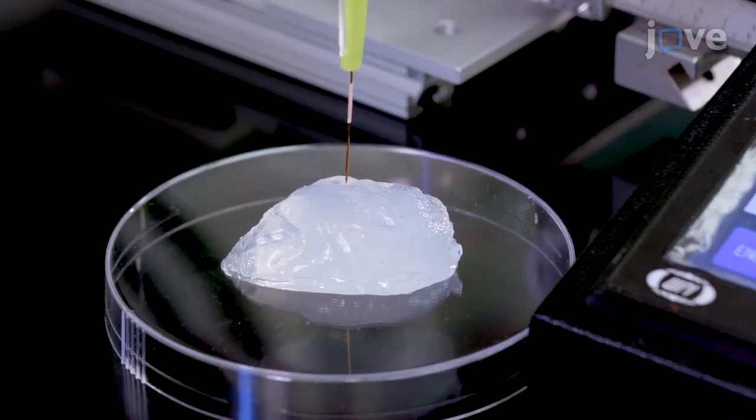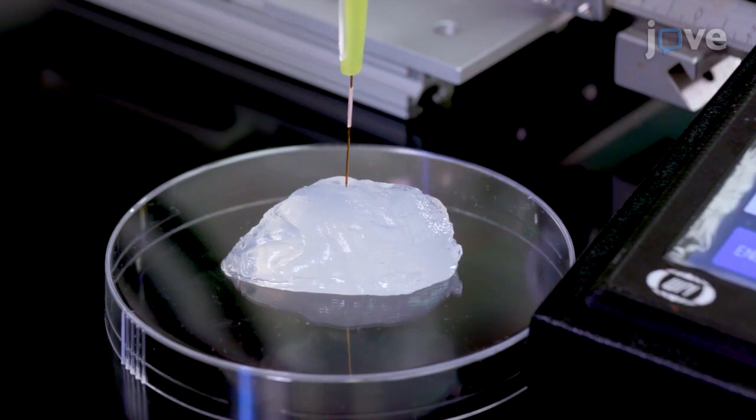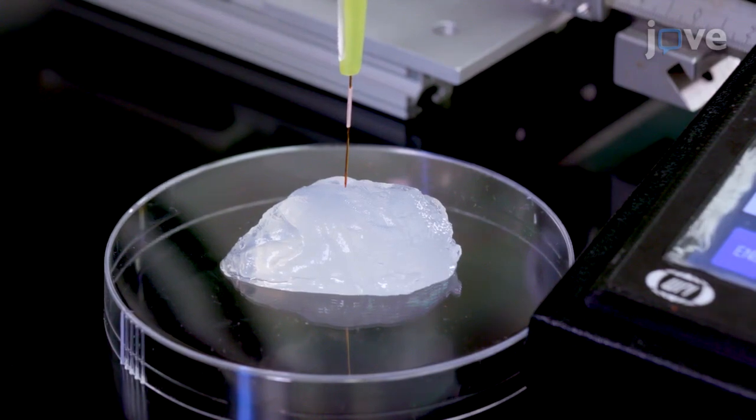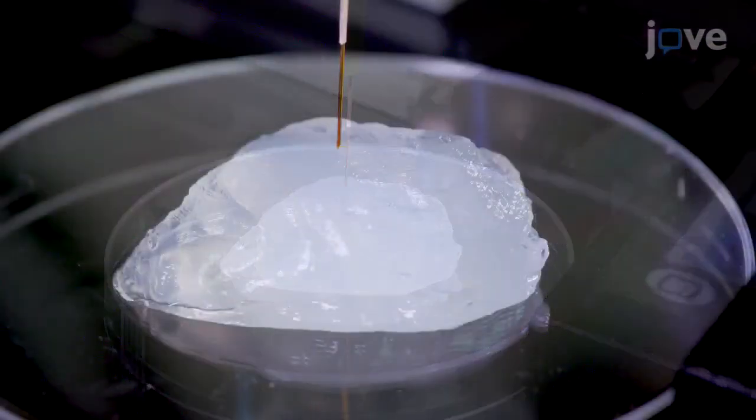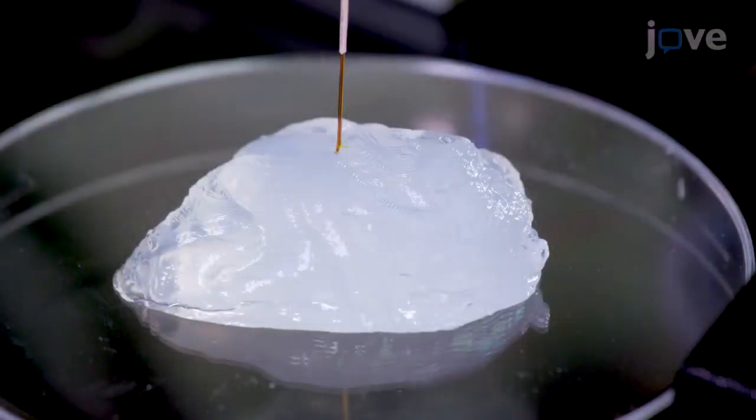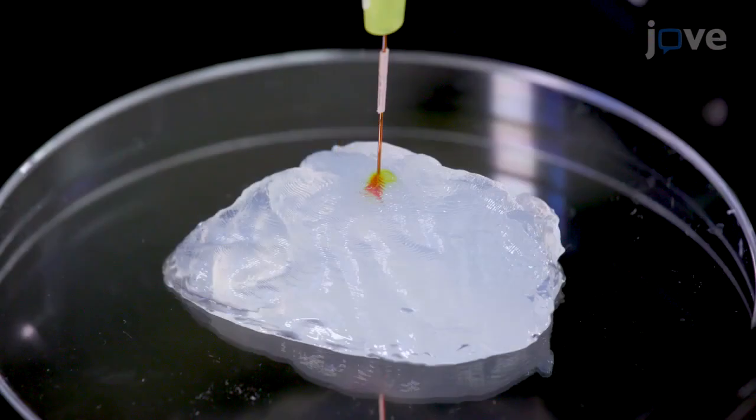This technique offers researchers the unique ability to visualize every aspect of their implantation or injection procedure and ensures that they can enter an operating room as prepared as possible.